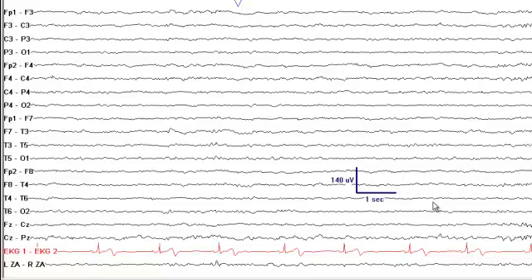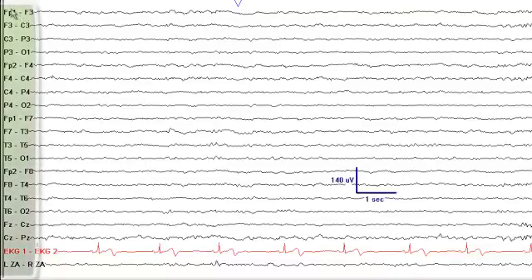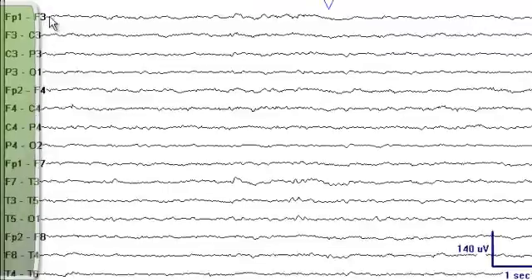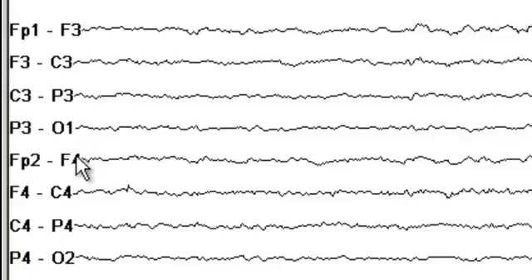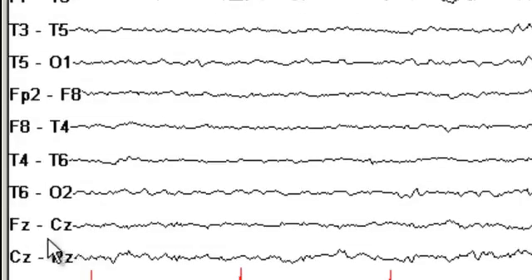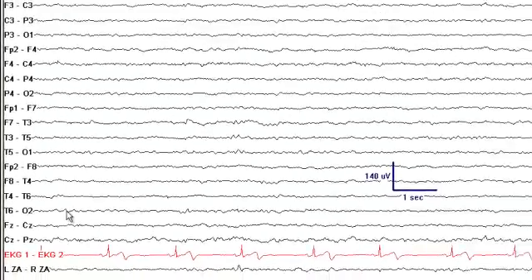Let's start looking at this EEG. We are looking at a bipolar montage. Electrodes labeled with an odd number record electrical activity from the left hemisphere, and those ending with an even number record from the right hemisphere. FZ, CZ, and PZ record electrical activity from the midline.